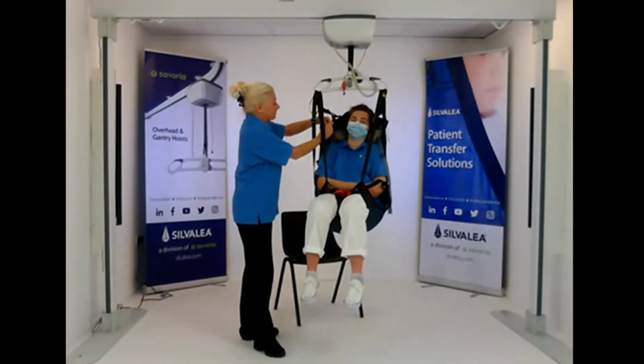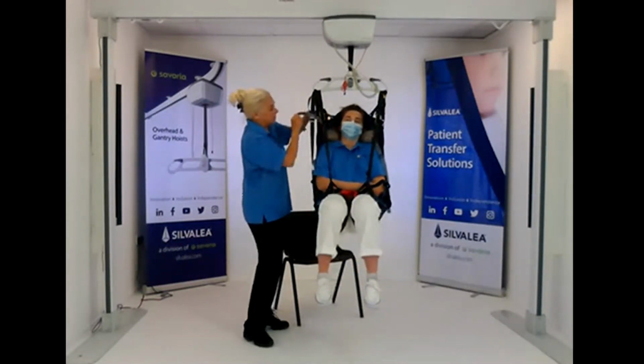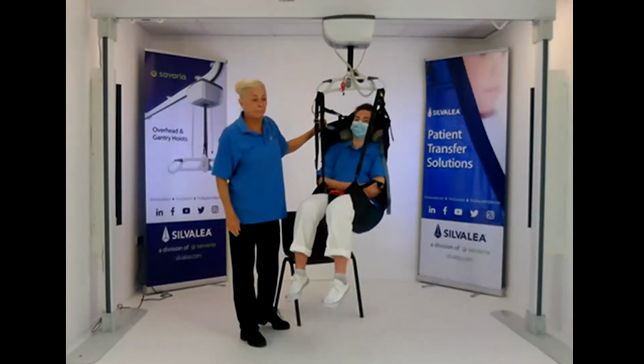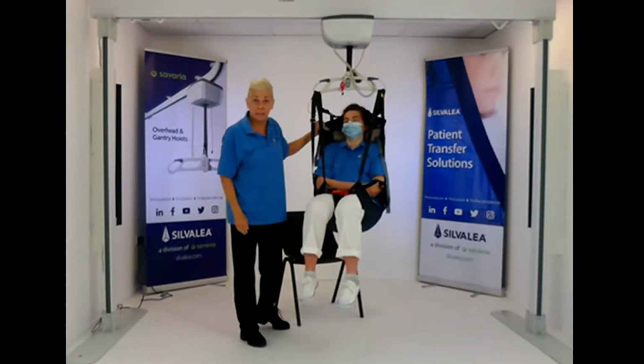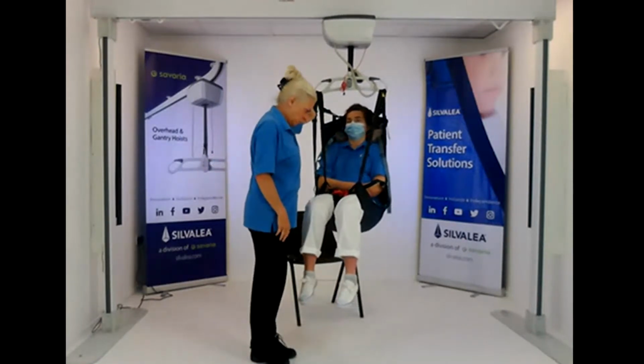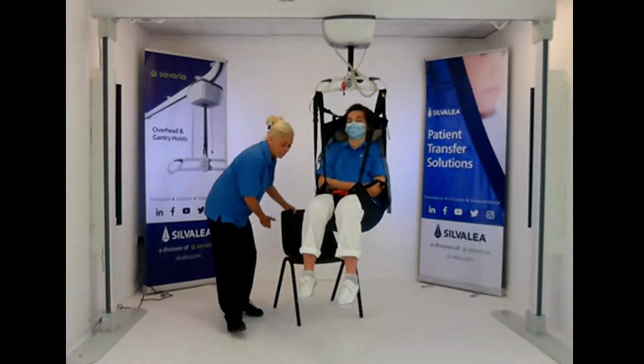Again, it's the same as the head support. It's got a loop, slider and a buckle. You just need to fix through one of the loops to keep it in position. Once it's set in position, then it's set. But it is sometimes better than having the head forced forward with a head support. So an accessory there that's helpful.